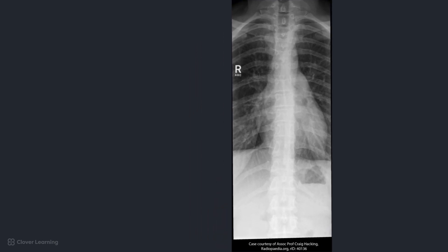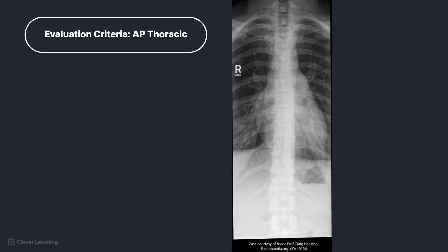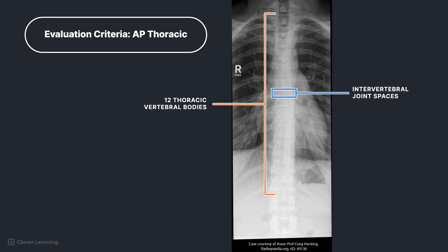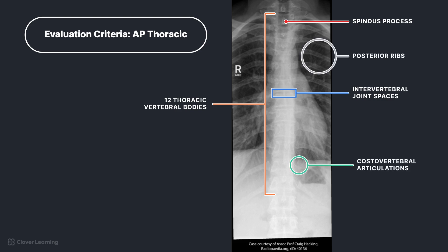If you said this radiograph is an AP projection of the thoracic spine, you're correct. While this may seem obvious to some, let's look at how we can tell radiographically. In this image, all 12 thoracic vertebral bodies, intervertebral joint spaces, and spinous and transverse processes as well as the posterior ribs and costovertebral articulations are demonstrated. It is a true AP because the sternoclavicular joints are equidistant from the spine and the spinous processes are demonstrated at the midline of the vertebral bodies.